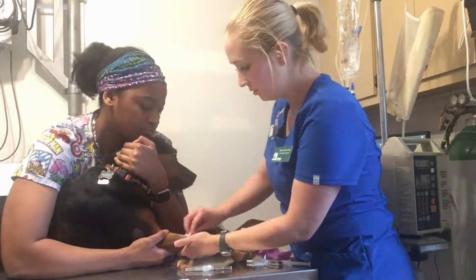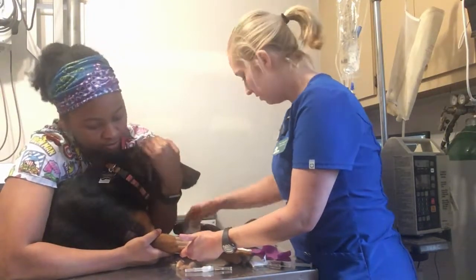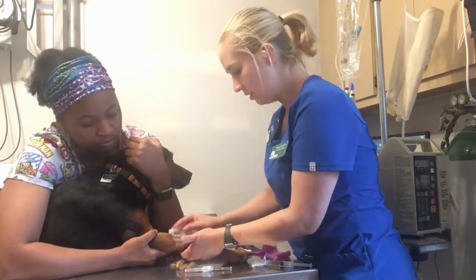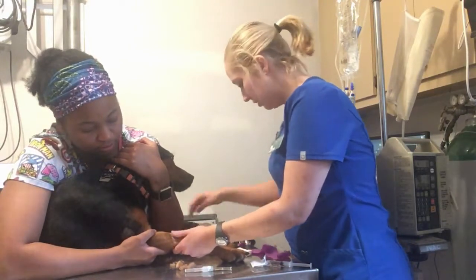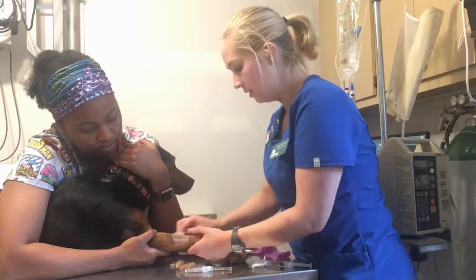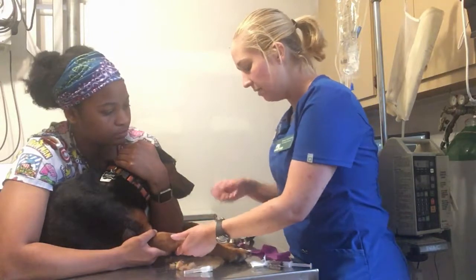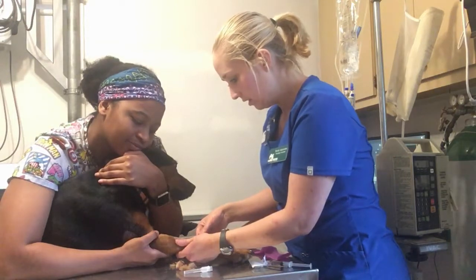Then I'm going to take my catheter, bevel side up, and gently insert it into the vein.